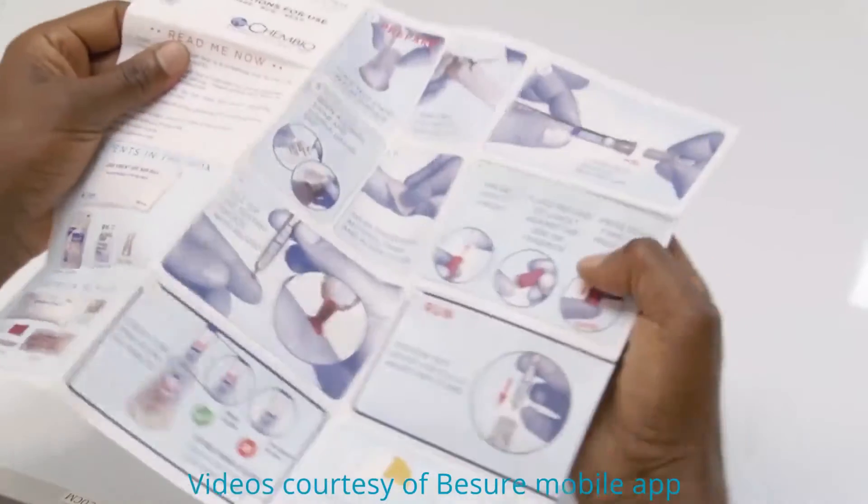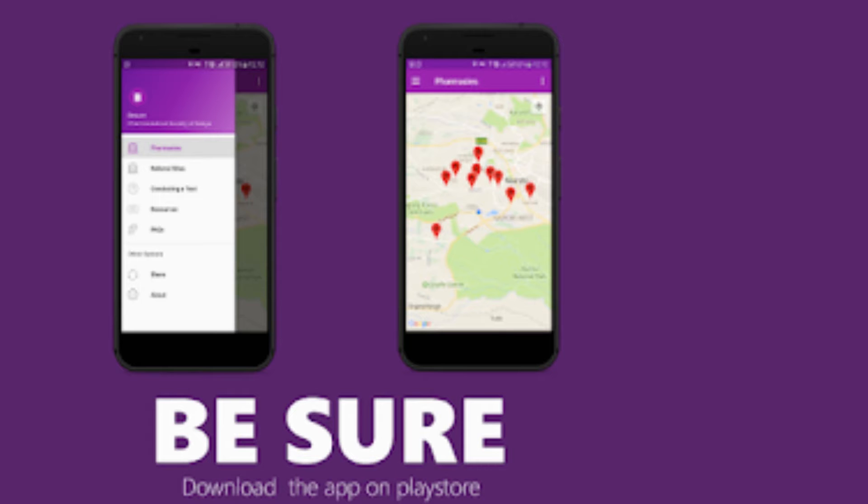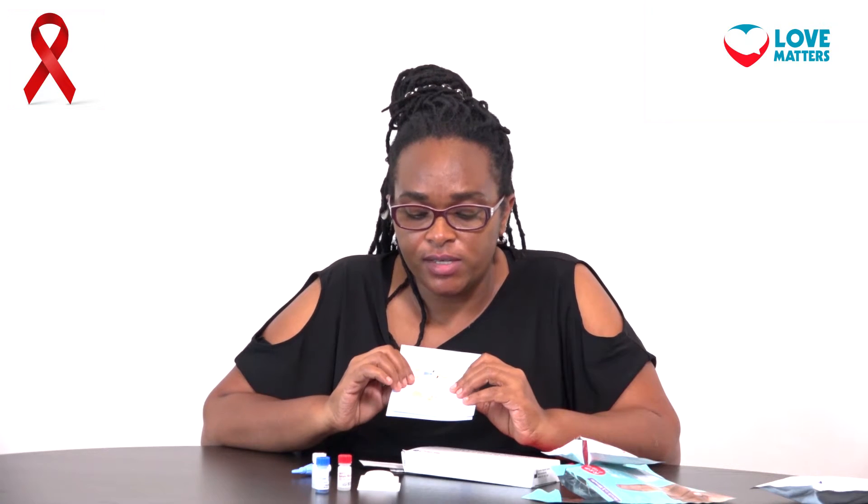Inside here are instructions — we'll go through that — and the instructions are both in English and in Swahili. There are simple instructions that you can use. You can also go to your phone and we have a BeSure app that you can follow, which has all the instructions and videos that show you how to use the test.